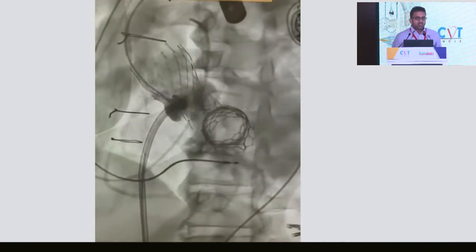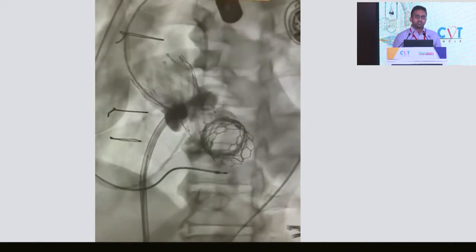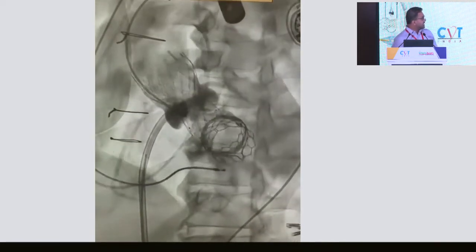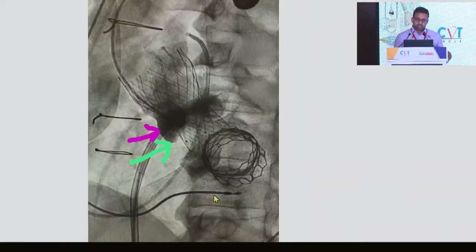Now, this is a very, very important slide. This is an aortogram. No matter what planning you do, this is the one that's going to tell us where the landing zone is going to be. Now, clearly, there is severe aortic regurgitation. I'm going to show you a still picture.